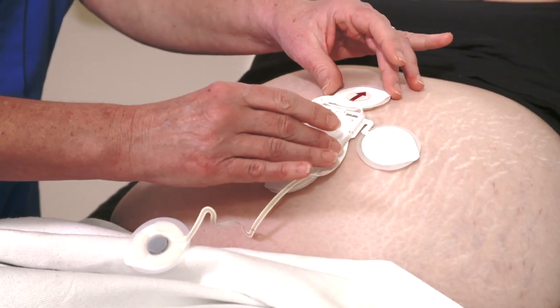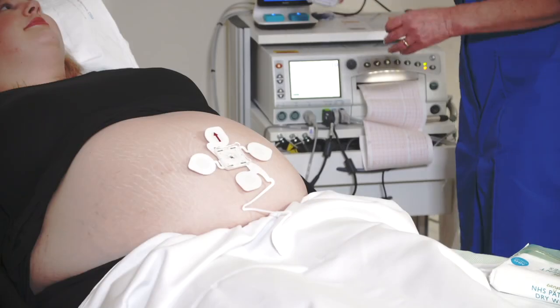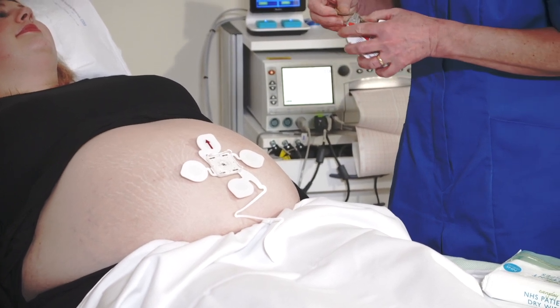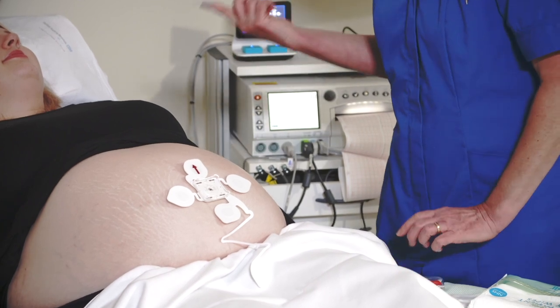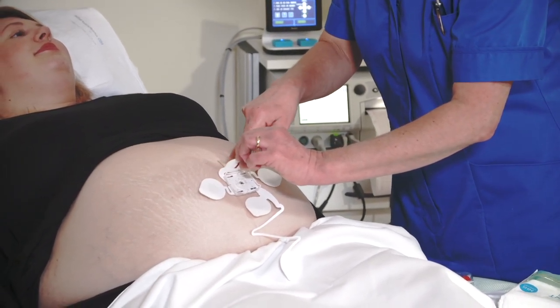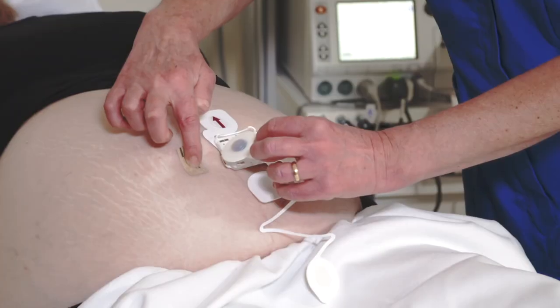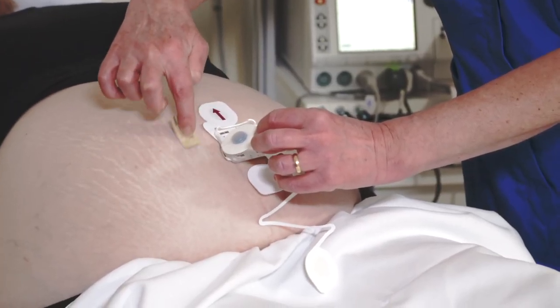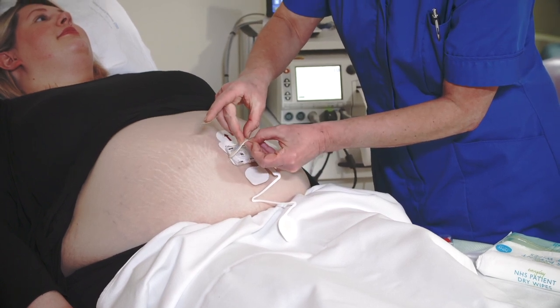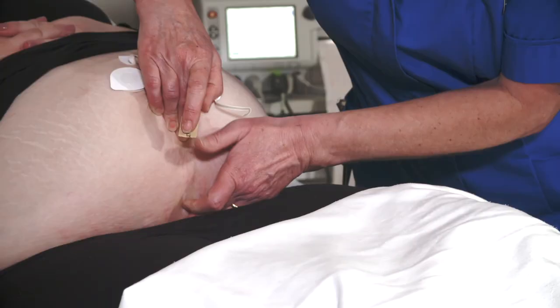If the mom has a piercing or other problem with the umbilicus or surrounding skin area where the electrodes will go, just move the clip to avoid the problem. Having placed the patch, both hands are now free to prepare the skin under each electrode. Take a 2cm strip of the 3M Skin Prep Tape — one side is sticky; use this side to stick the tape to your index finger. Lift up one of the electrodes around the clip and use the Skin Prep Tape to exfoliate the skin under the center of the electrode. Use firm, short strokes, lifting your finger after each stroke. Make three strokes in one direction over the same area of skin, then repeat to create a cross pattern. The center of the electrode needs to match up with the center of the cross. Once done, remove the protective film and stick the electrode down firmly, trying to avoid pressing the central gel area. Repeat for the remaining electrodes around the clip.